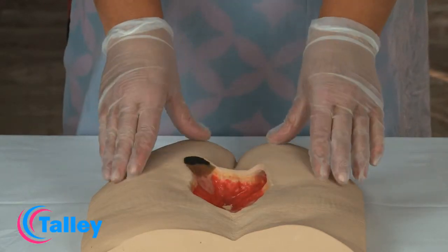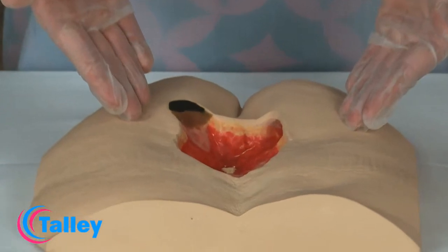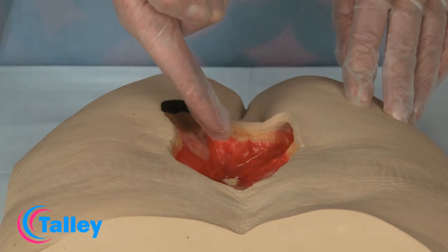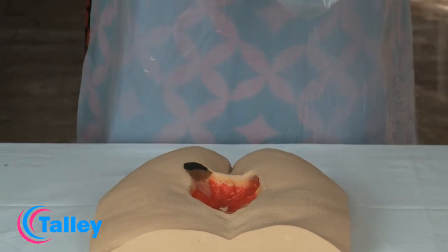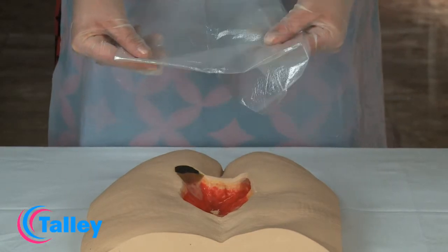The peri wound of this wound is healthy and intact, therefore no barrier protectant will be applied. In this grade 4 pressure ulcer, there is an area of exposed bone. The exposed bone and any underlying structures — for example tendon, fascia, and sheath — must be protected with a non-adherent contact layer.